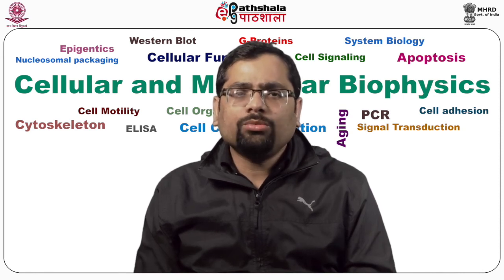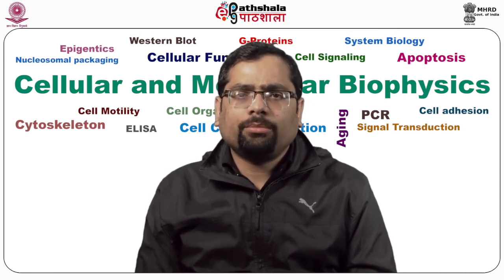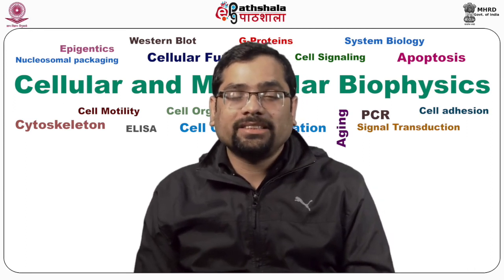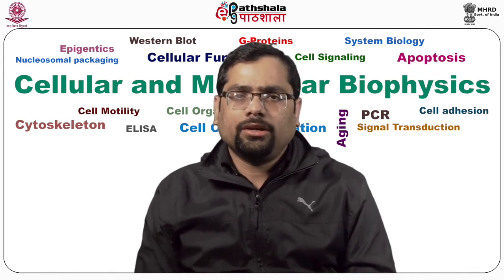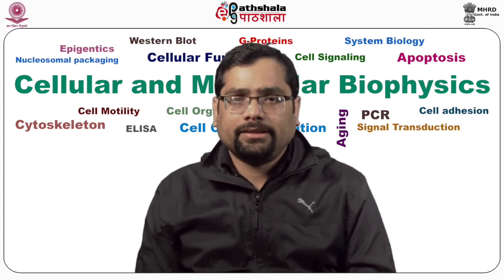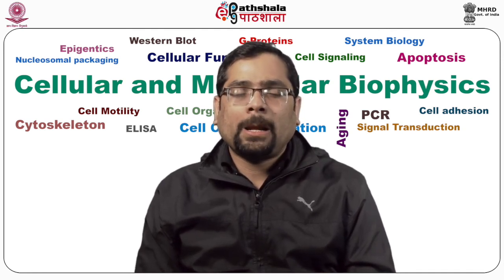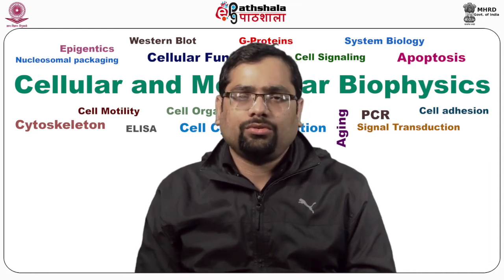Cytochrome C oxidase, a marker of metabolic demands, holds the potential to provide more direct information about neuronal activity than hemoglobin. But cytochrome C oxidase is not used as extensively as oxyhemoglobin or deoxyhemoglobin, but it can be used since it is a marker of metabolic demands. So, it has the potential to provide more direct information than hemoglobin about the neuronal activity in the brain or any other tissues.